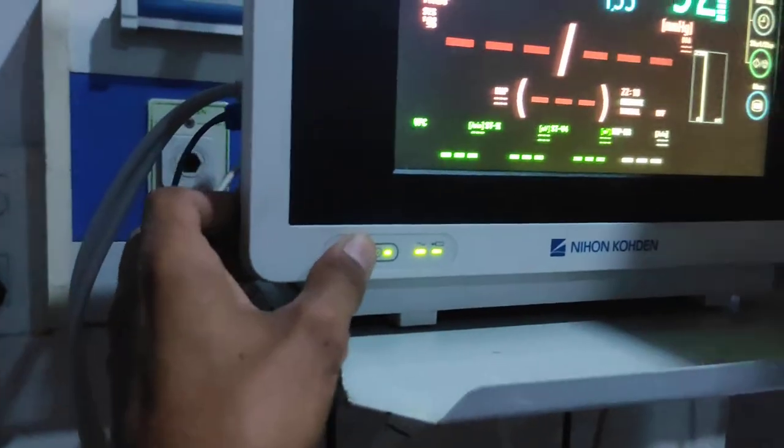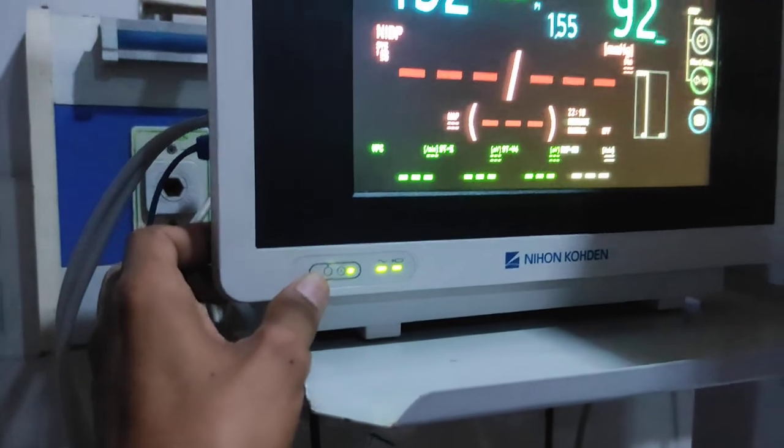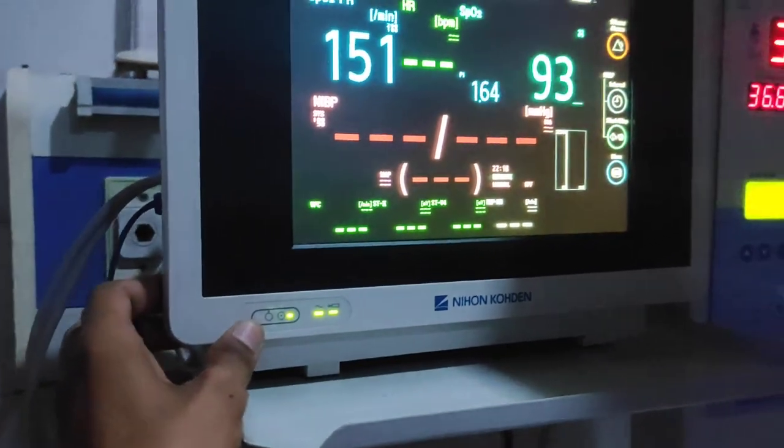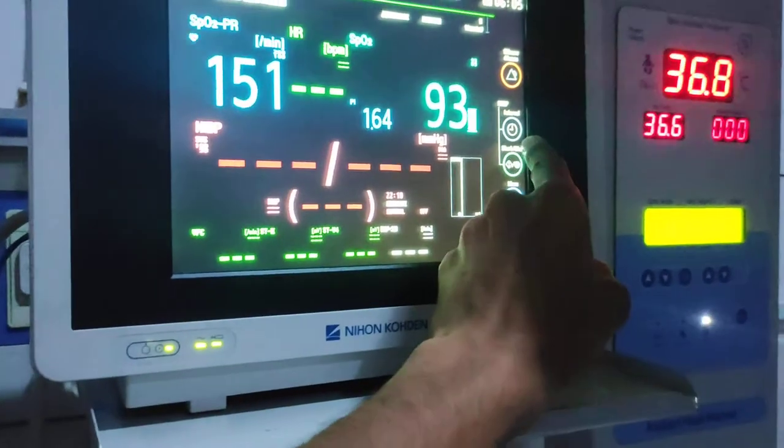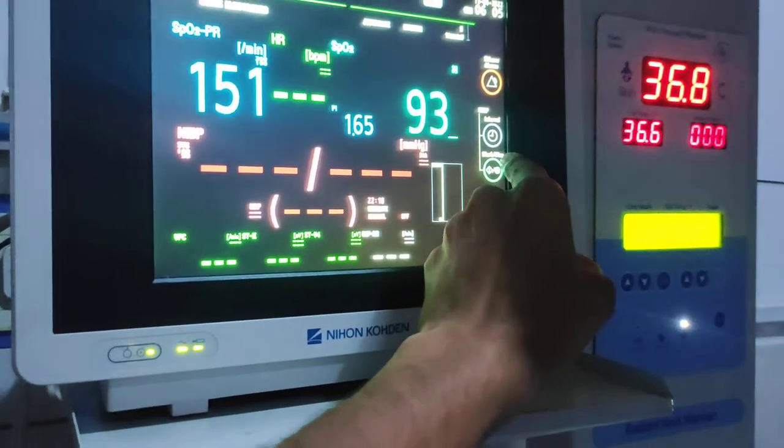Here is the on/off switch. And when we take BP, we start here.